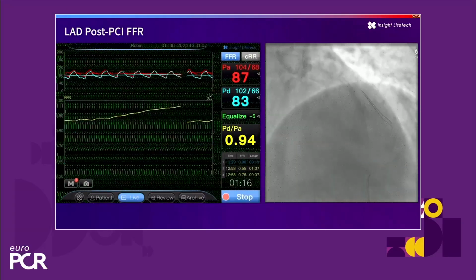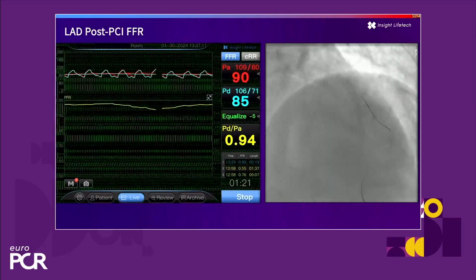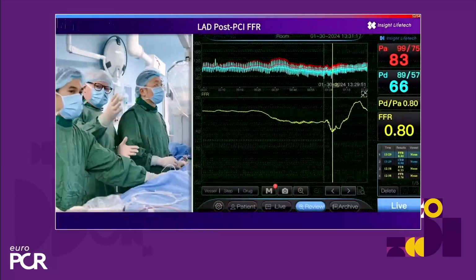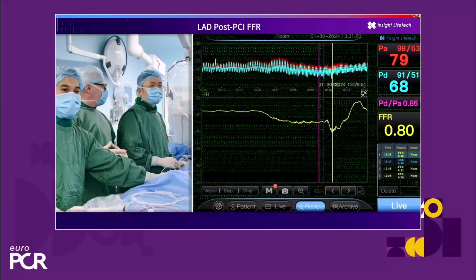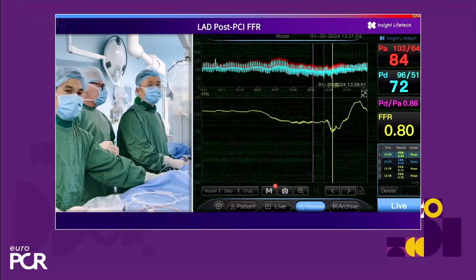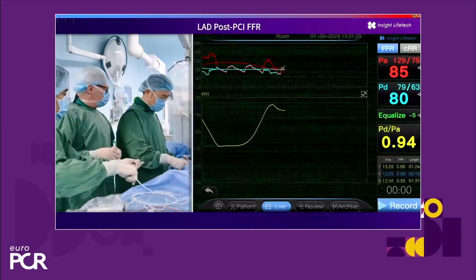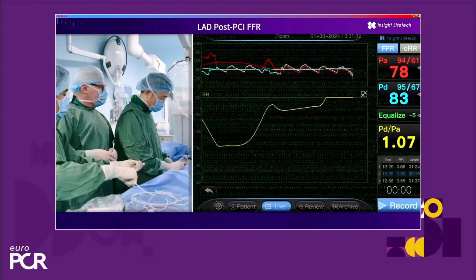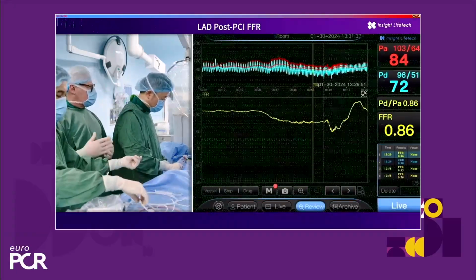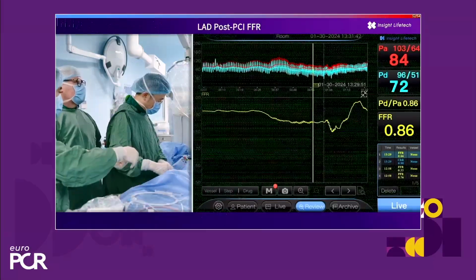And it looks like that we have not significant gradient across the stented segment. We have just some residual gradient across the ostial LAD, but it is quite diffuse. And of course, it is also important that we want to treat this. We need to go for left main stenting in case of good lumen, not the very big plaque burden, and only small gradient there, and very good result according to physiology and intravascular imaging.